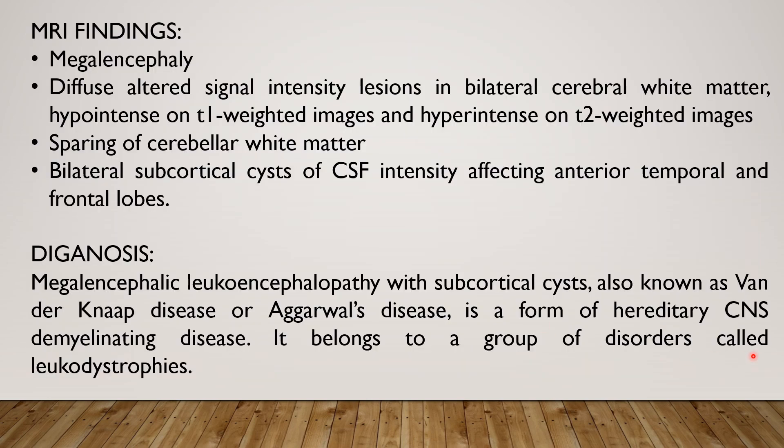To summarize the findings: there is megalencephaly; there are diffuse altered signal intensity lesions in bilateral cerebral white matter, which are hypointense on T1-weighted images and hyperintense on T2 and FLAIR images; there is sparing of cerebellar white matter; and there are bilateral subcortical cysts of CSF intensity affecting the anterior temporal and frontal lobes.